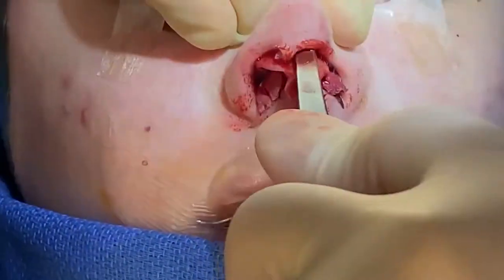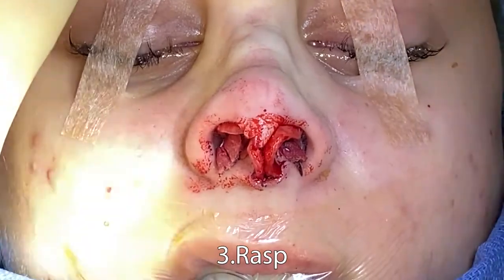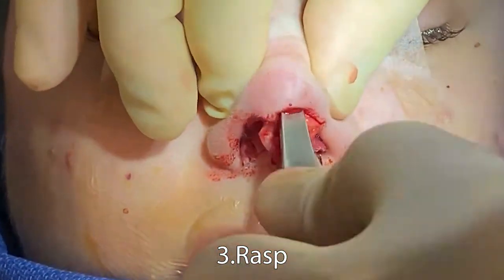Down-biting rasp — right, left, clean the kerf, right, left, clean the kerf.